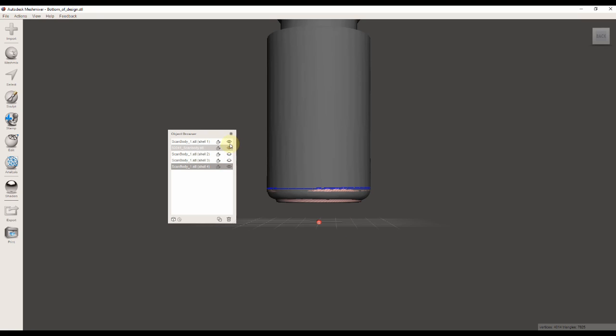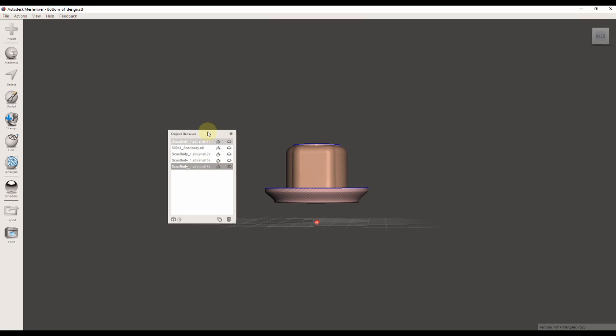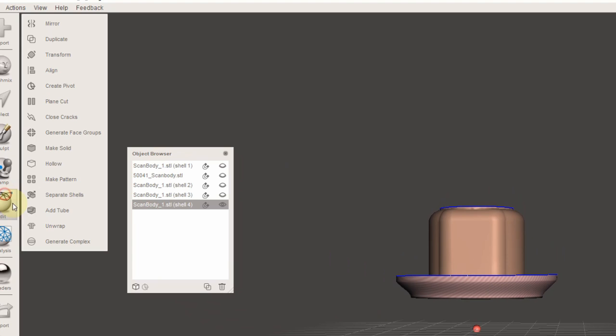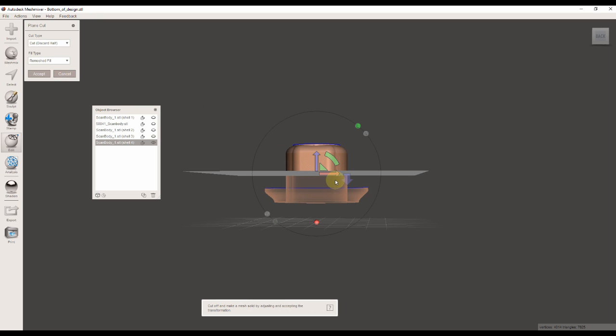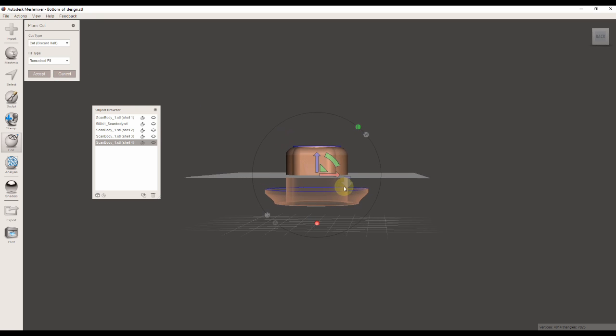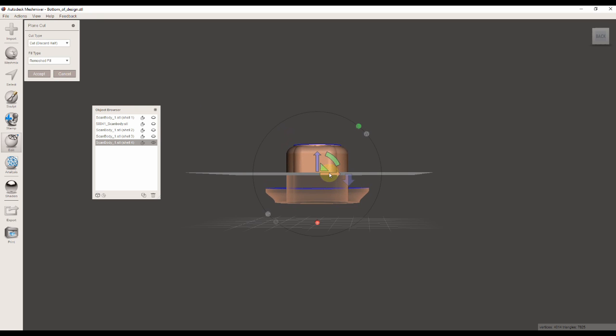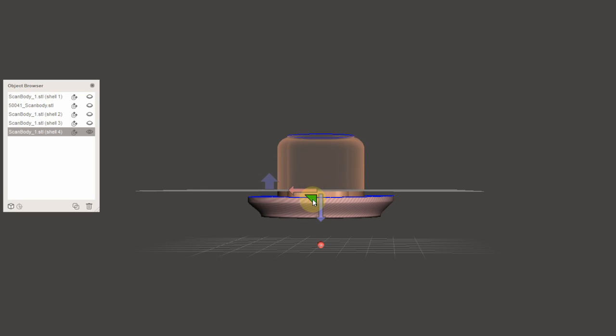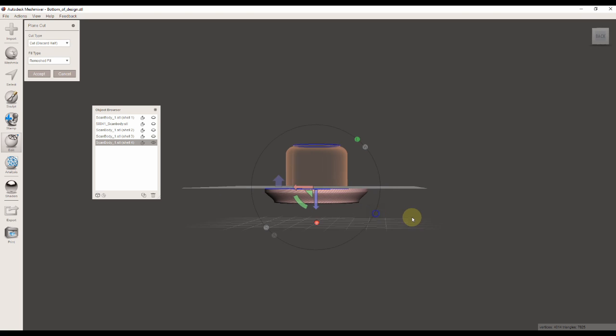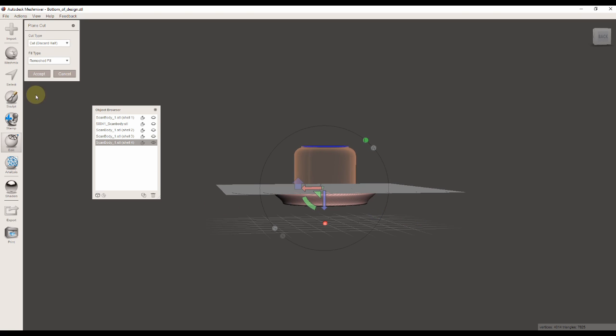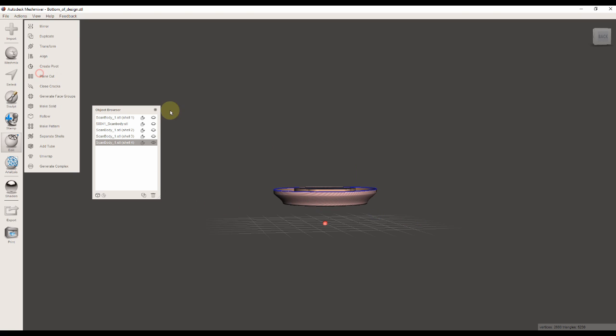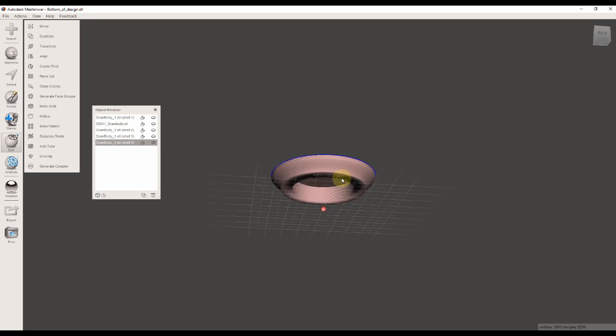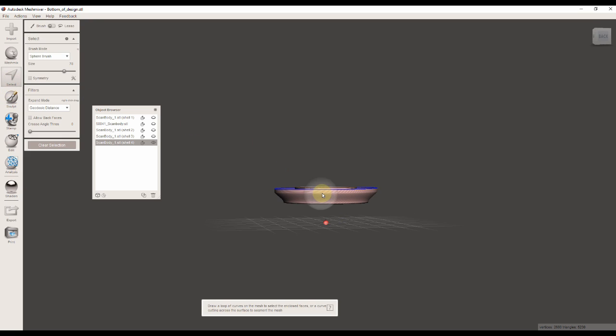Now I'm going to start with some cleanup of the different parts. The first thing I'm going to clean up is the bottom of the design. I don't really need the top part. All I need is the bottom part, so I'm going to use a plane cut tool to cut the top part completely off.